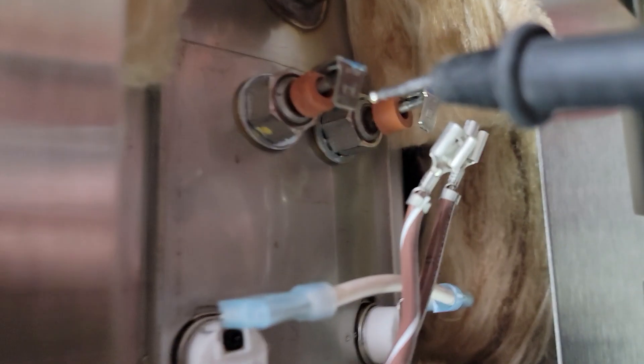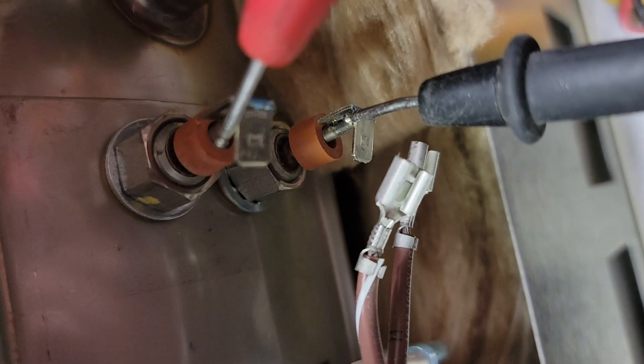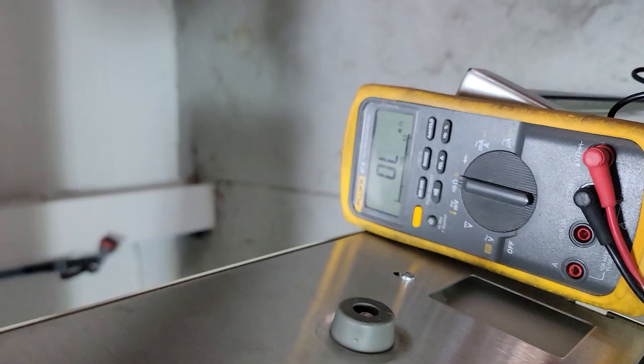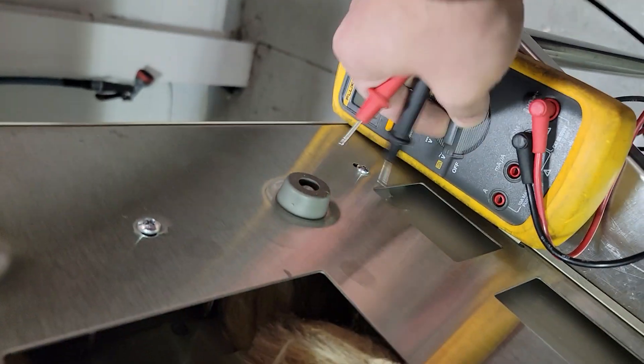We just touch our leads to the heating element contact and look at our screen. We are reading 11 — great, so we're good. Nothing wrong with our heating element; that's one less thing to worry about during troubleshooting.